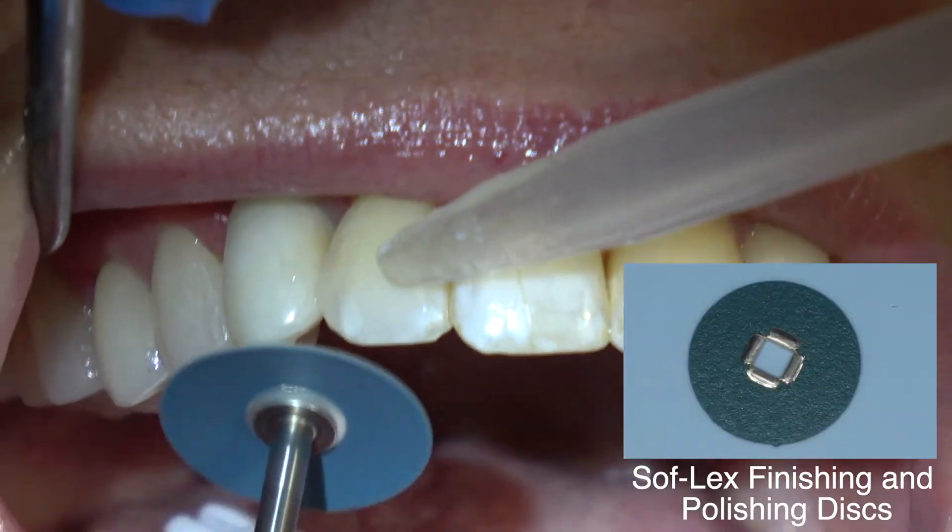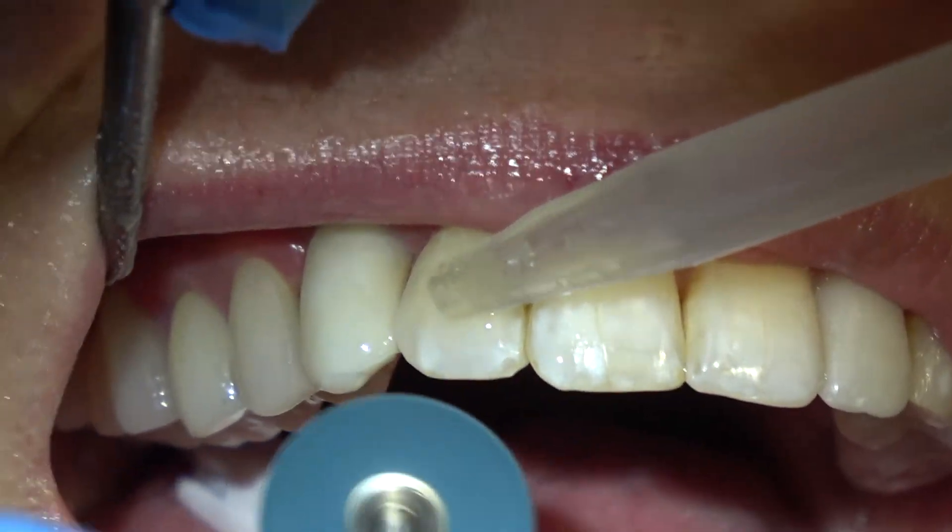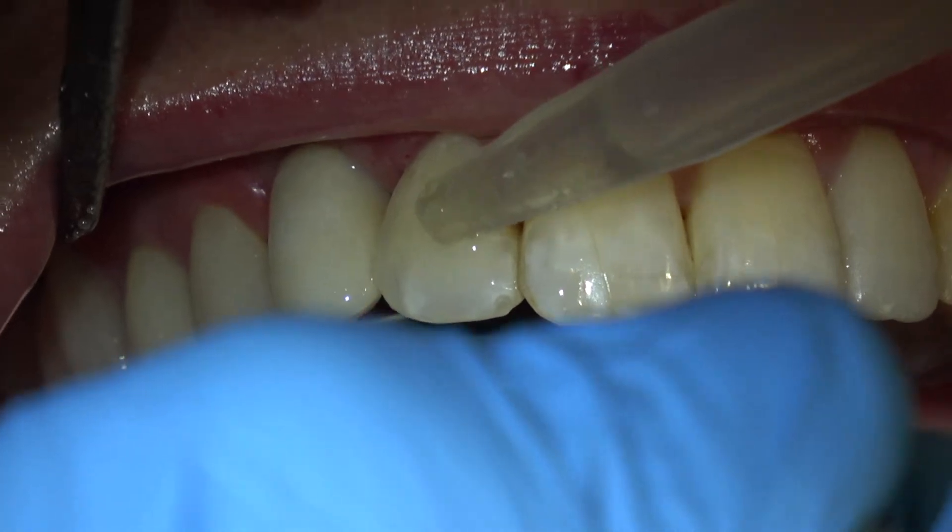Let's check the occlusion — be sure it's ideal. This is a Shofu disc, a polishing disc. Get it nice and smooth.